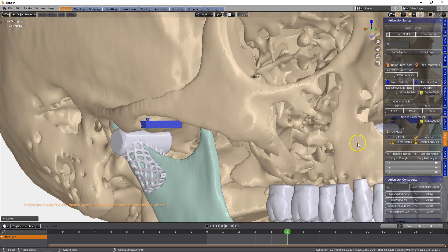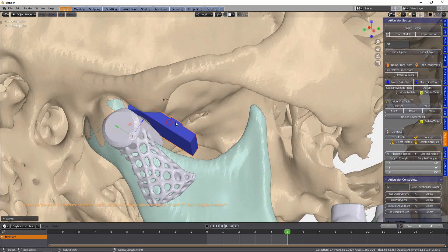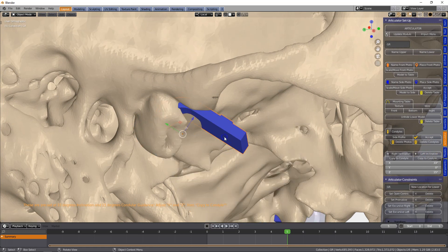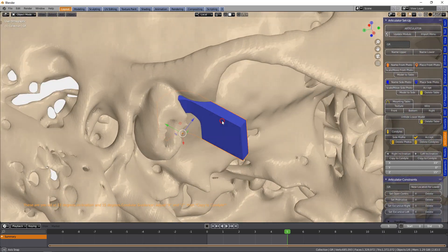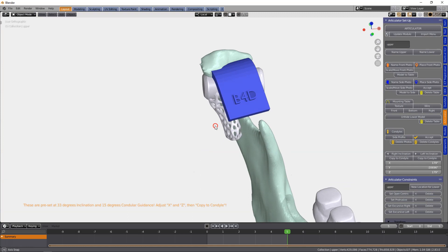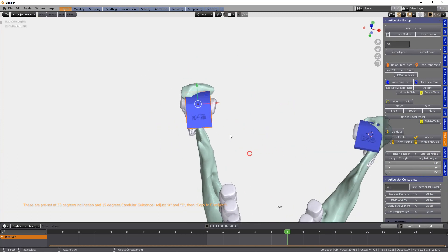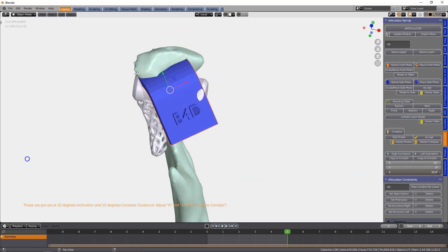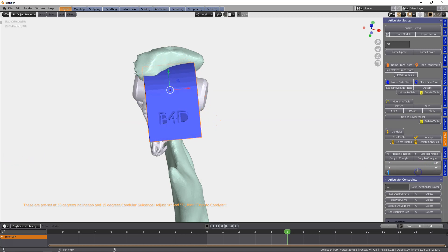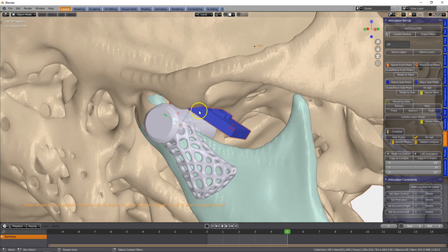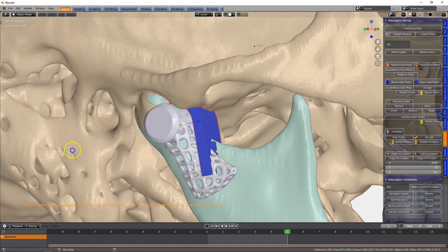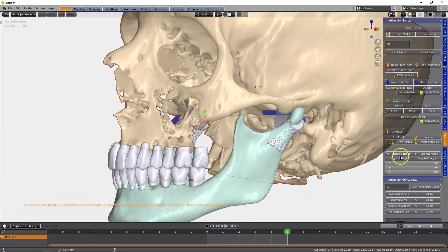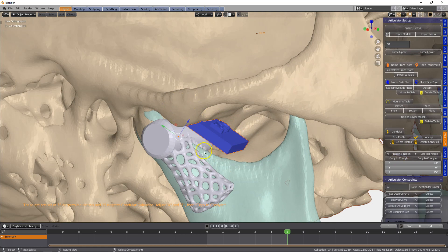Now they are almost in a good location. I've set the inclination of the condyle, and when we hide this we can sort of see how the TMJ eminence is, and then we can also change the angle. This is set at 15 degrees, which seems rather good because it follows the long axis of the mandible. We can change that accordingly, but we're going to leave this at 33 degrees.